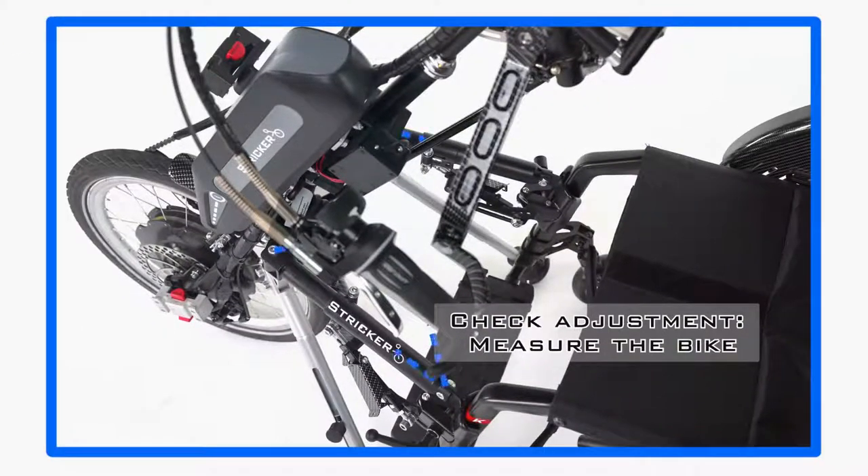To check whether the bike is adjusted symmetrically, you can now measure the handbike or power assist device in all directions.